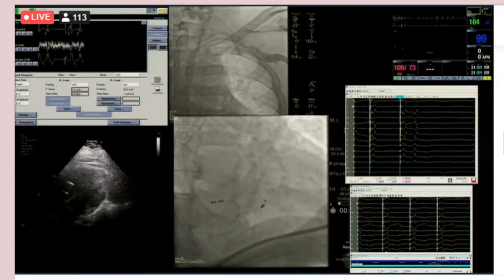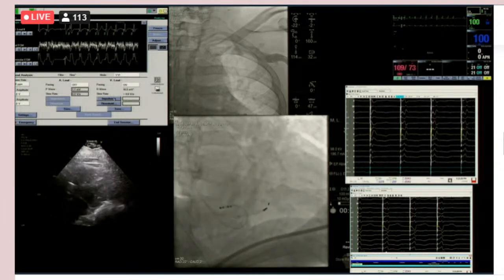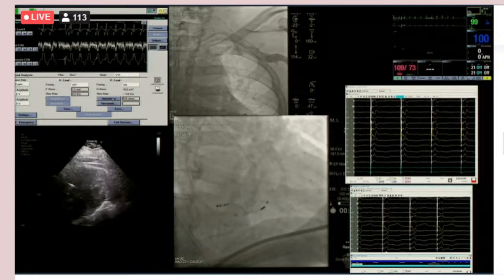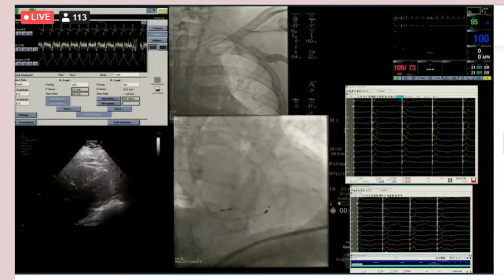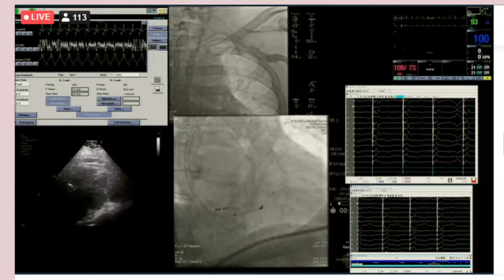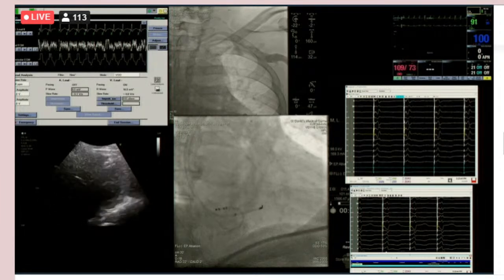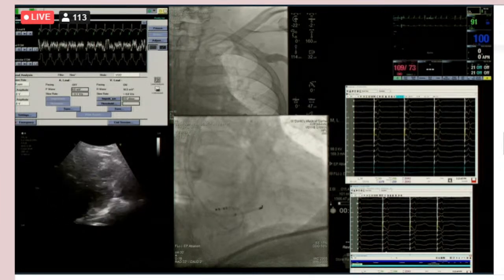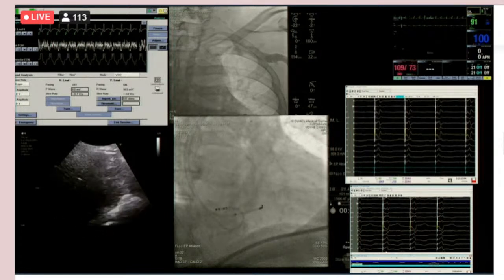There was a little widening of the QRS there, yeah. 514. 514. Press down. Okay. Almost see that? Where, can you see it on the septum? Carol? Yeah. Sorry, it is on the septum. Point it out to me. Can you guys open up the septum at all? We can. Yes. We can see the Medtronic signal. We can see everything.